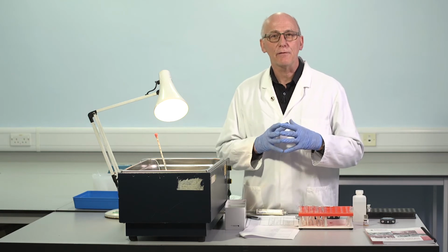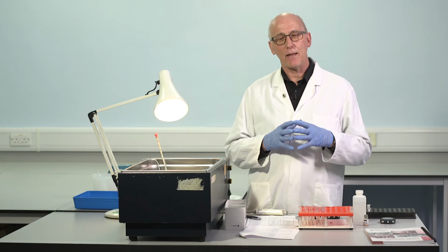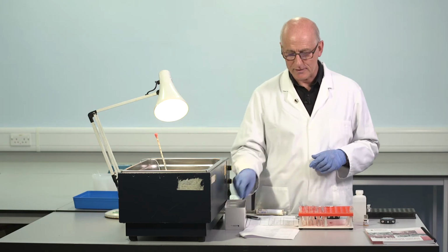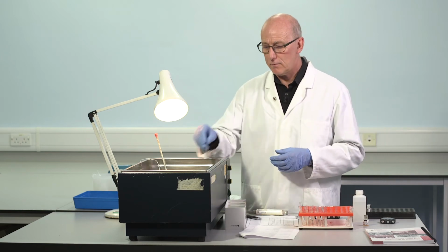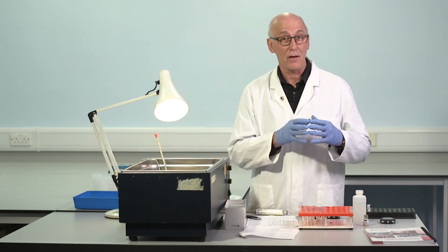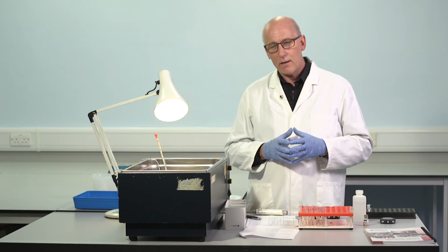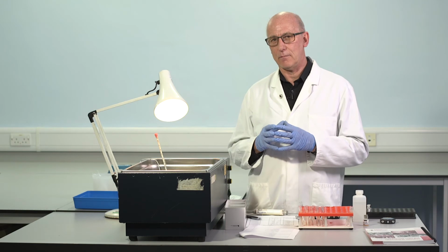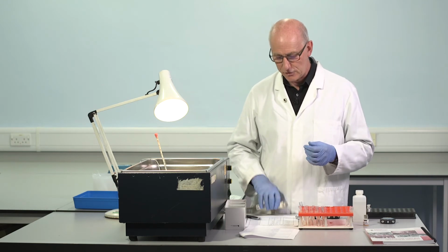There is one more piece of information we need, and that helps us interpret the results in the patient sample where we obtained very long clotting times. 140 seconds, 141, 142, very similar clotting times in 3 different dilutions. So what we need to know is, what would be the clotting time of this assay system if we didn't add any factor VIII? That's an important piece of information.